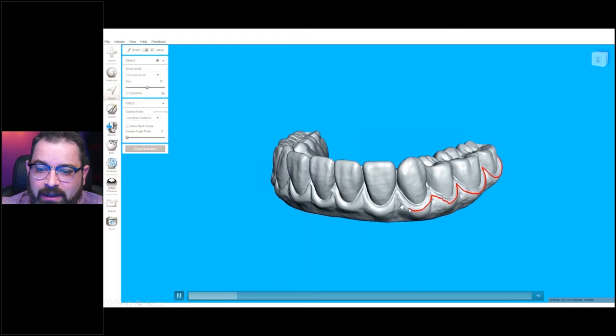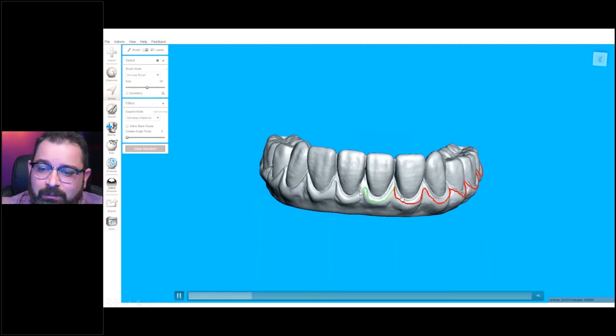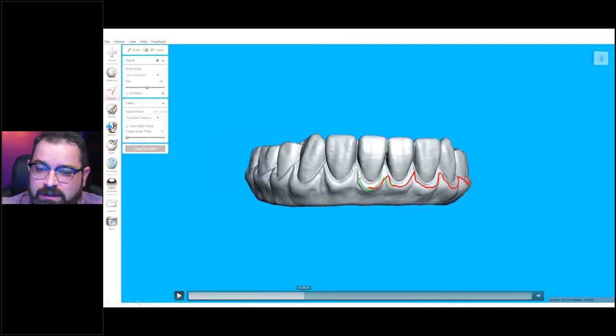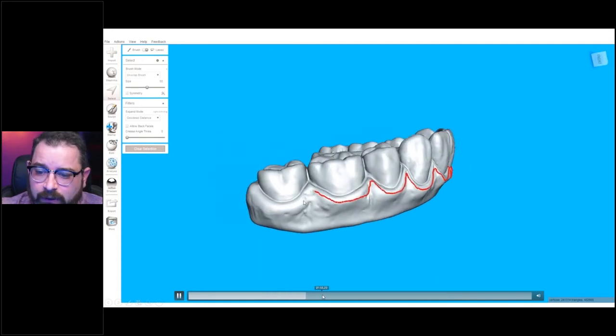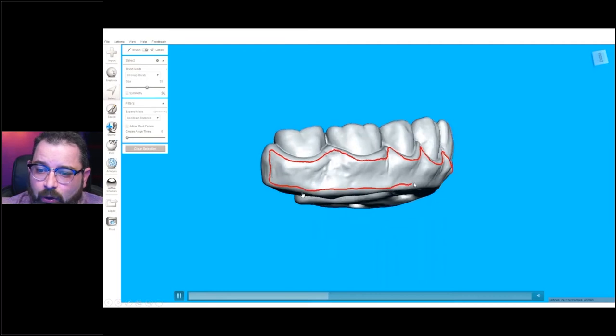I'm going right by the teeth. I don't want to go too close to the teeth, because when I do that reduction digitally, it can end up cutting into the teeth and creating holes. So I'm actually pulling away about a millimeter from the tooth and going forward making those lasso selections all the way around. When I'm going to the bottom, I try not to go all the way to the bottom.